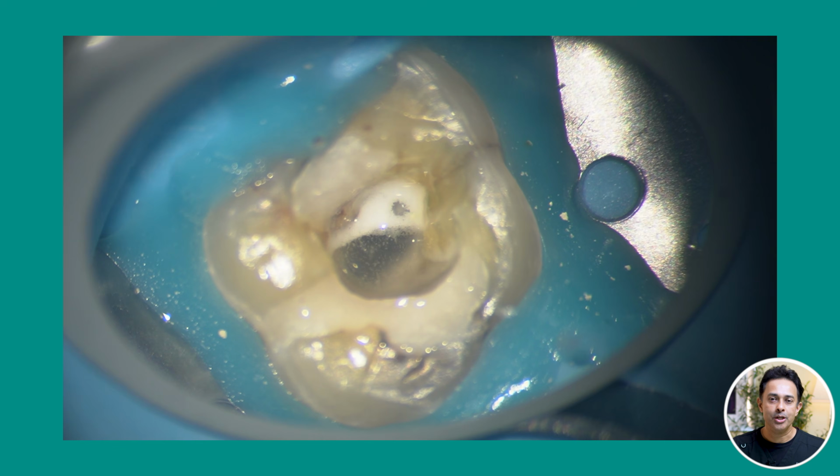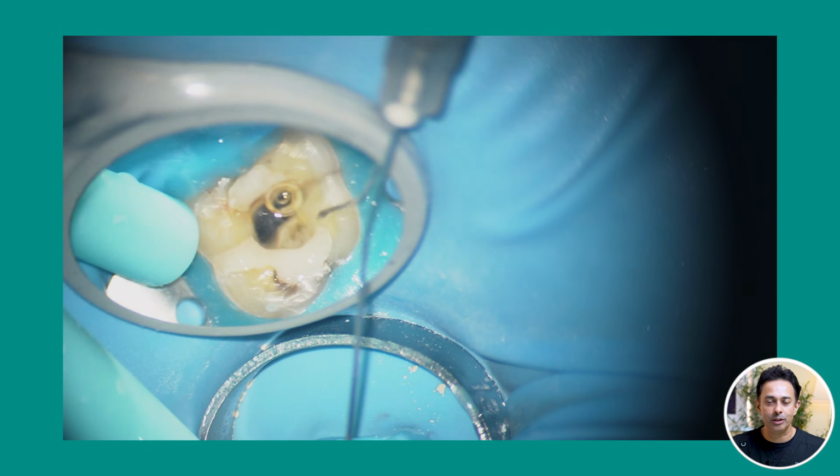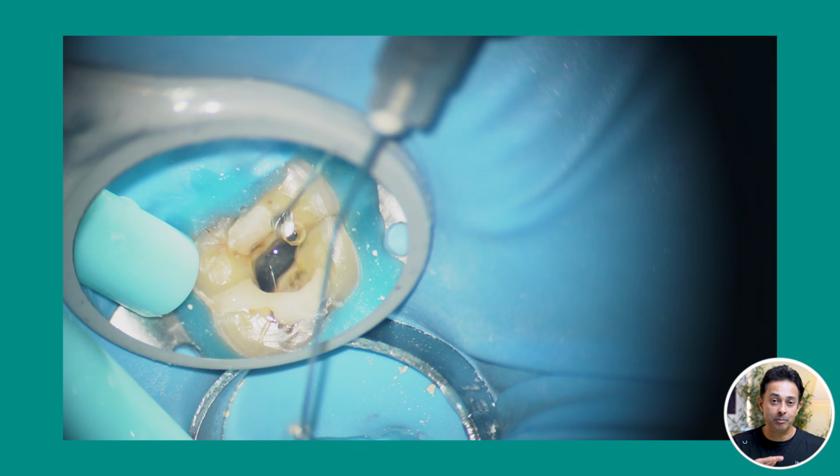It has to be a combination of exchange of fluid. So you want to put the sodium hypochlorite, wait for it to digest some pulp, and once the loose tissue comes into solution, you want to keep introducing sodium hypochlorite. So you keep replenishing the sodium hypochlorite so that you get some irrigant flow in the canal.